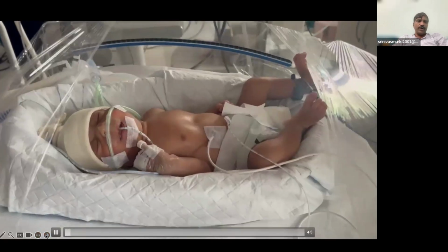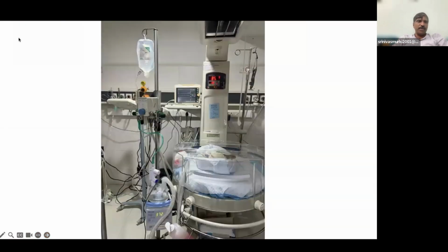Now, one more video here. Maybe you can tell me what is the problem here. What is shown here? What is the problem here? So this baby again is on CPAP. Temperature display is 37. Maybe this baby is on 21%.